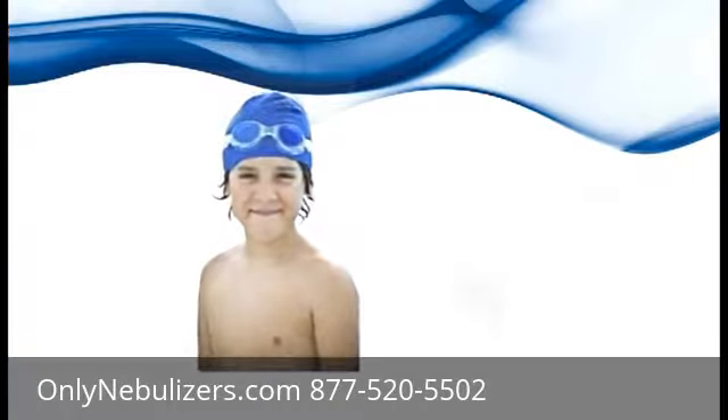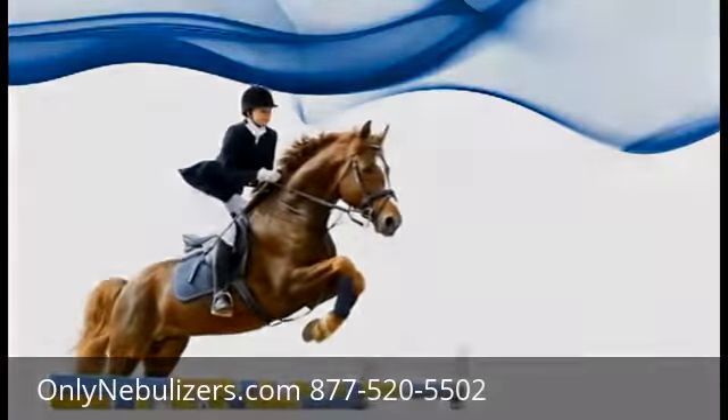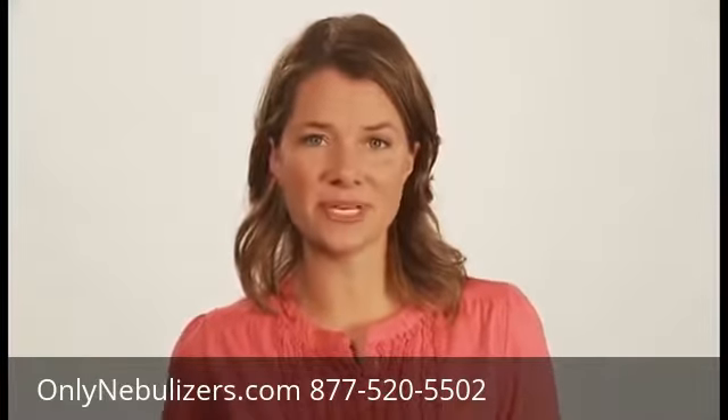Developed for those with active lifestyles, Trek S is the solution for freedom wherever life takes you — with portable technology. Hi, I'm Brooke, and we're here to show you just how easy the Trek S is to set up and use.